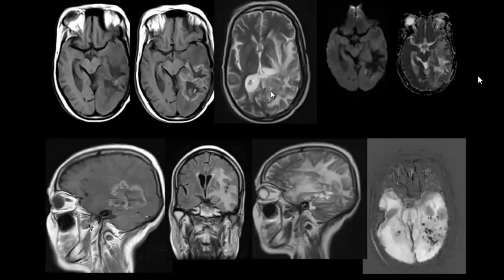So doctor, this patient had a surgery of the solitary brain metastatic deposit. You can see the craniectomy defect here. Later on, the surgical bed was radiated, so these are post-radiation changes. How will you differentiate between tumor recurrence and post-radiation changes?